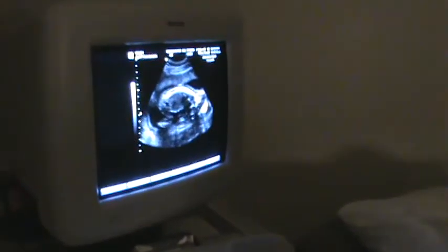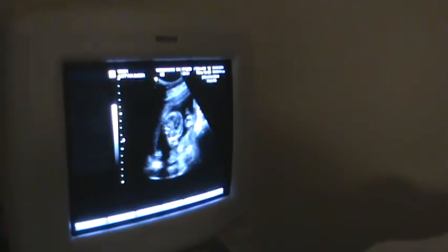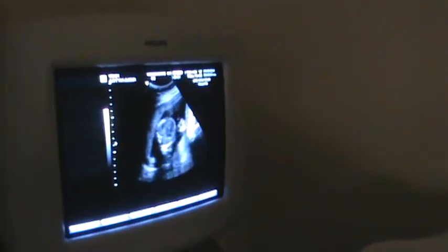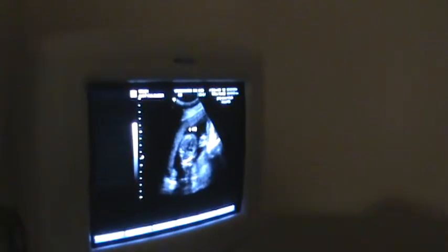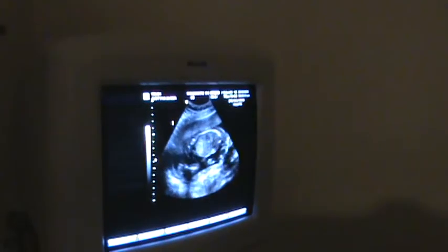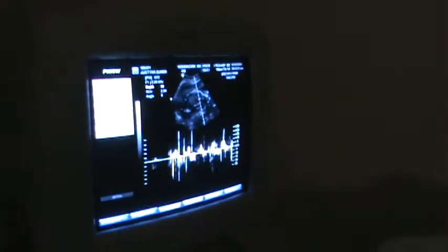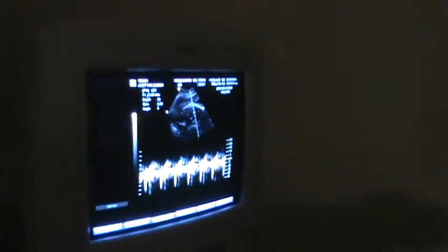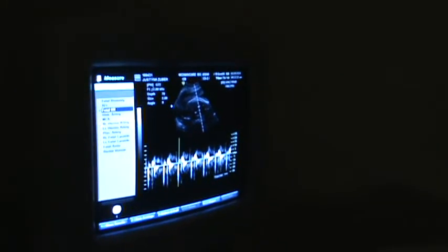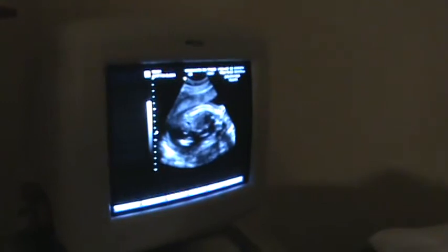Is that the heartbeat? Yeah! So we're going to go for that next — and that is a four-chamber heart. You'll see the cross that looks like little butterfly wings opening and closing. This divides the heart right to left, and that's the mitral and tricuspid valve, giving you two atriums and two ventricles. It rules out about 70% of all cardiac abnormalities — beautiful. 120 to 160 is appropriate, and you are at 146, just right in the middle. Don't like over 200 or under 90. And then this is the aorta — you'll see this little black river that pulsates right here. That takes the blood out of the heart and feeds it to the organs. Aortic arch — it looks great.